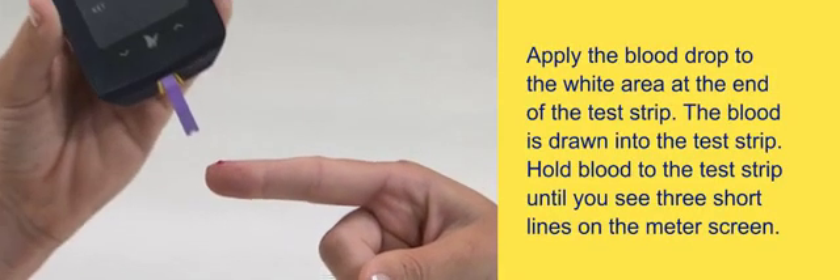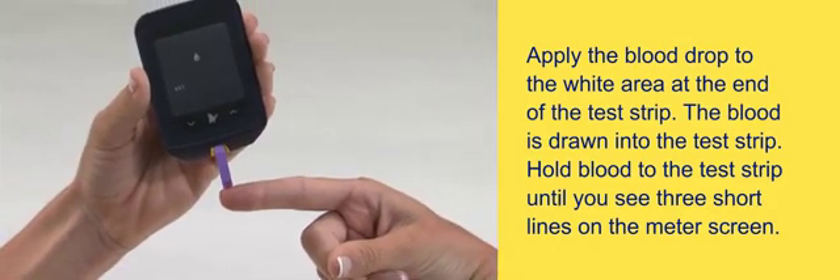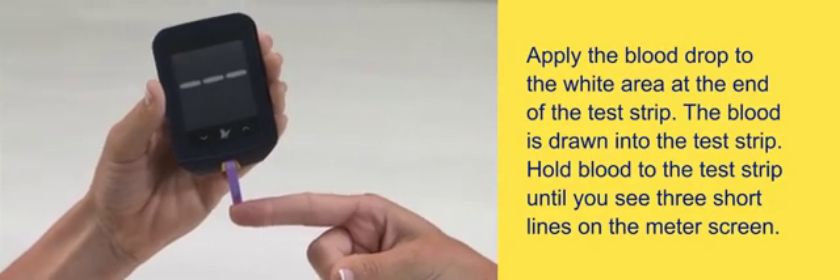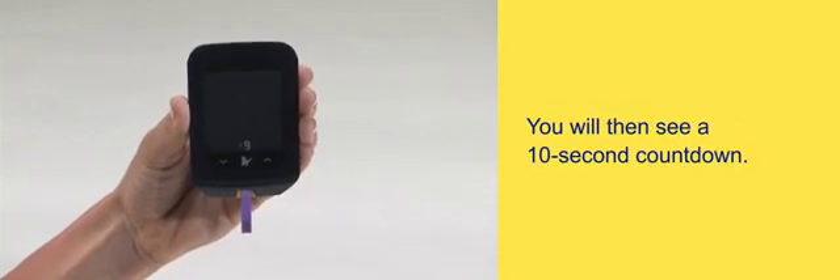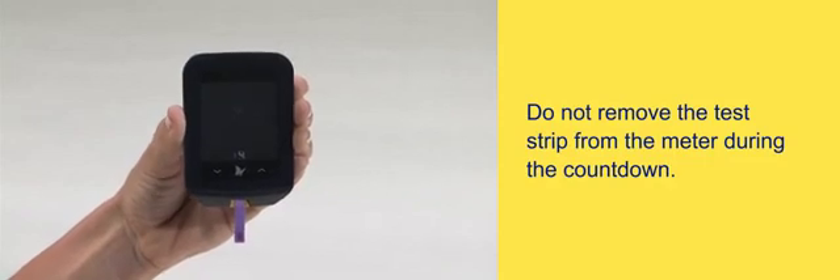Apply the blood drop to the white area at the end of the test strip. The blood is drawn into the test strip. Hold blood to the test strip until you see three short lines on the meter screen — this means you have applied enough blood. You will then see a 10-second countdown. Do not remove the test strip from the meter during the countdown.